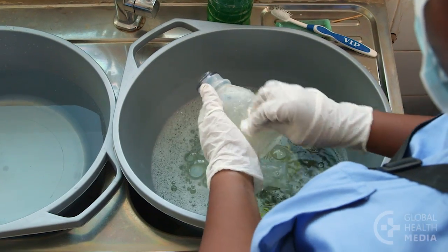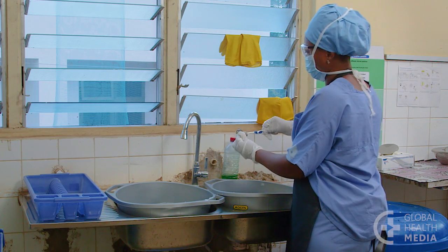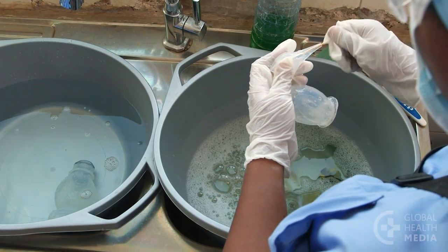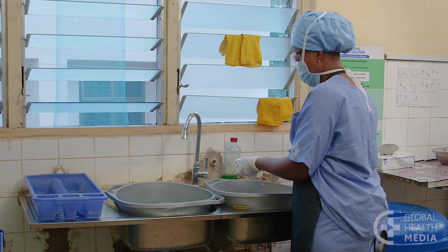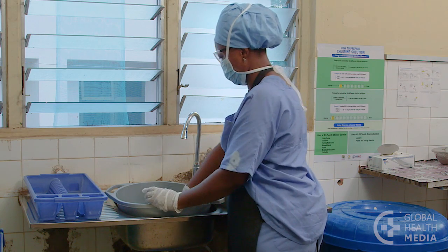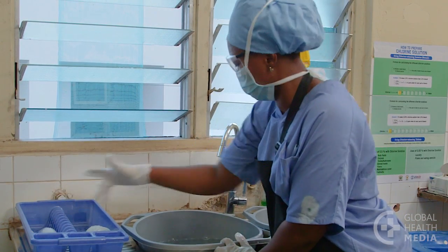Now, scrub all surfaces of each part inside and out in soapy water. Use a clean cloth and a soft brush. A toothpick can be used to clear the tip of the suction device. After washing, drop each piece in a bucket of clean rinse water. Immerse the parts and move them around in the water to remove the soap. Then, set them on a rack to dry.